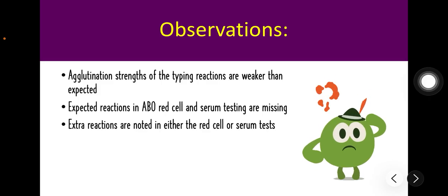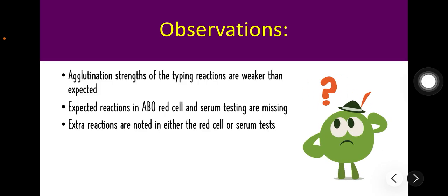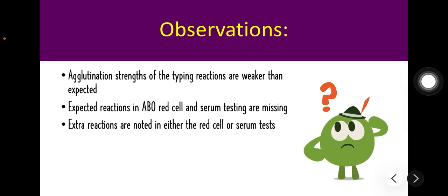We also have the cold allo or autoantibodies. Antibodies like anti-big I, anti-big M, or anti-P1 react best at room temperature. Since reverse grouping is done at room temperature, these antibodies may clump the reagent cells regardless of the ABO type.